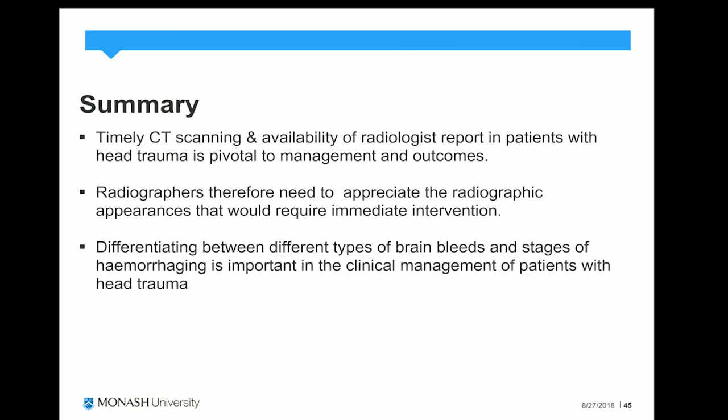So radiographers therefore need to appreciate the appearances that they see on a CT scan, because quite often they do these scans after hours, in the early hours of the morning, and you don't always have a radiologist around you. So you need to ensure that there's someone that can provide a report immediately so that immediate intervention can take place. It's important to be able to differentiate between the different stages of brain bleeds, from acute to subacute to chronic, as this influences the clinical management of patients with head trauma.